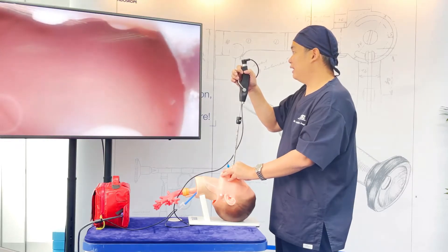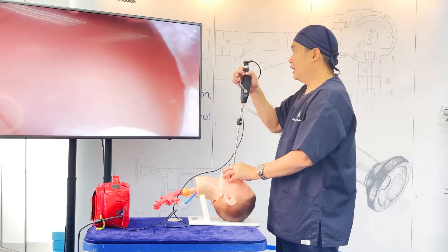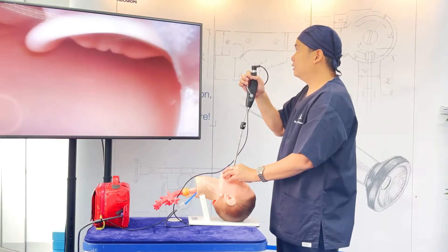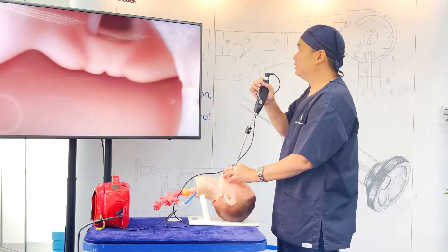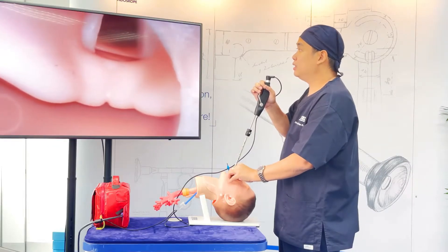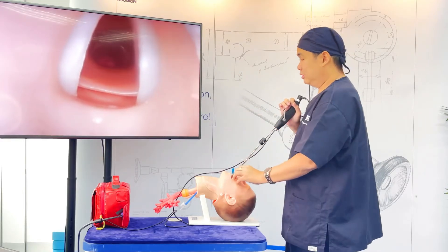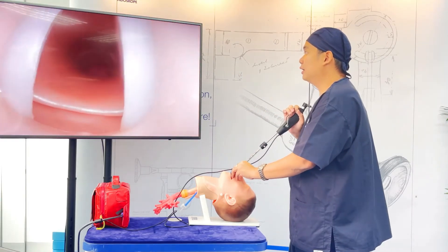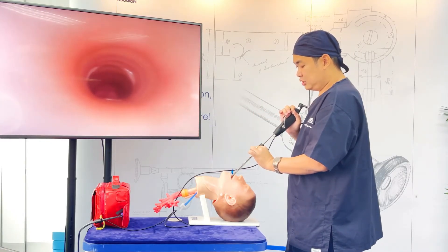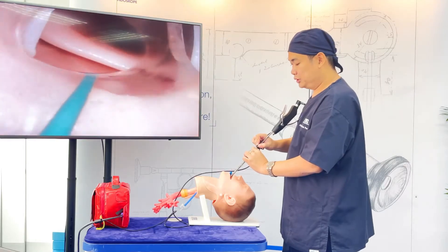Once I'm at the level of the uvula — you can see the uvula at the bottom of the screen — I press the lever a little bit harder for it to go more anterior. I even pull the scope a little bit towards me. Then I enter the vocal cords. Once I've entered the vocal cords, I release the ET tube from the tube holder and just push down the ET tube.